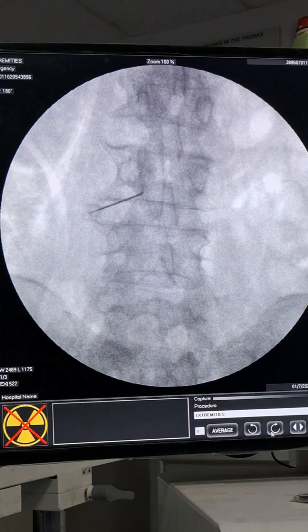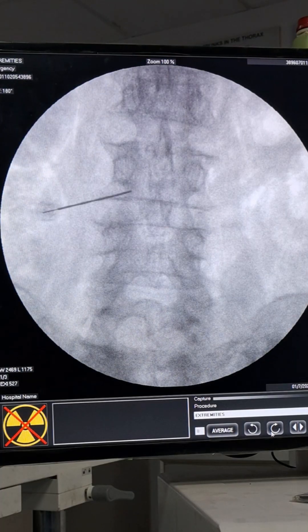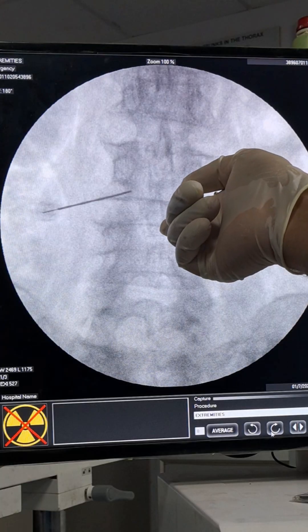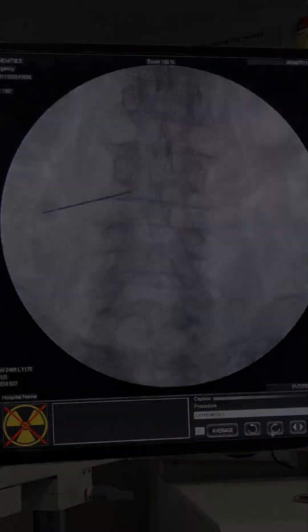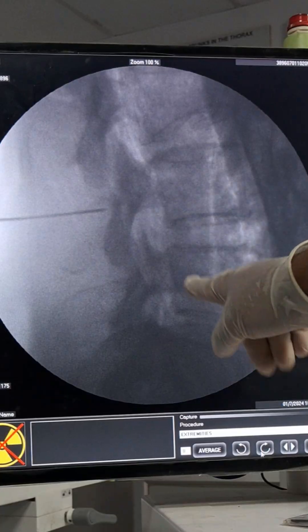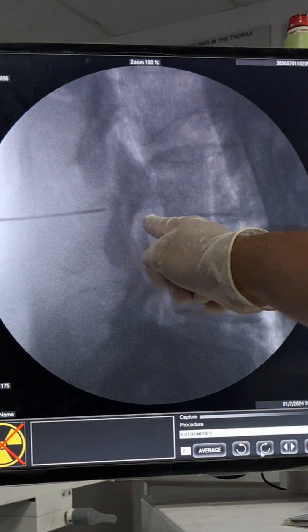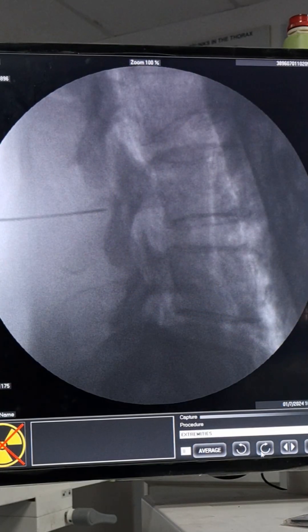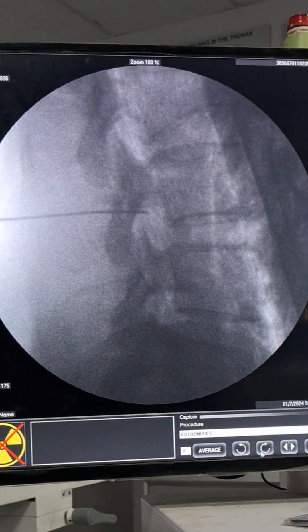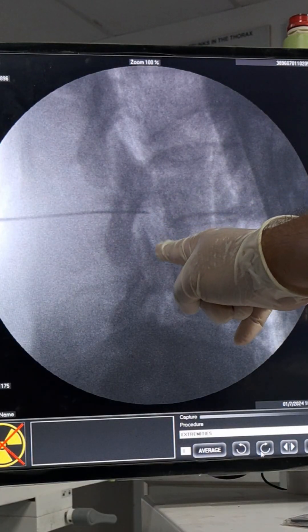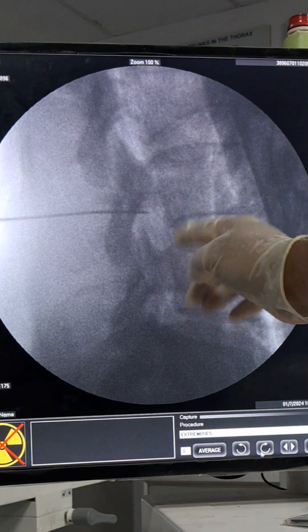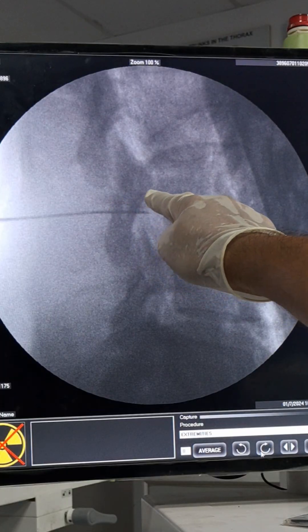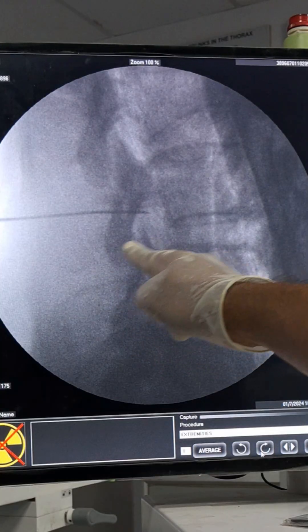In AP view you can see the needle coming obliquely touching the pars. Now in lateral view I will take the needle past the pars to enter into the foramen obliquely. The needle is now just behind the pars. Now I will overcome the pars and enter into the foramen. The needle has entered into the foramen; I am keeping it just posterior to the dorsal root ganglion. Imagine the dorsal root ganglion is here and its root comes out like this. For the subpedicular approach the needle will be a little high.